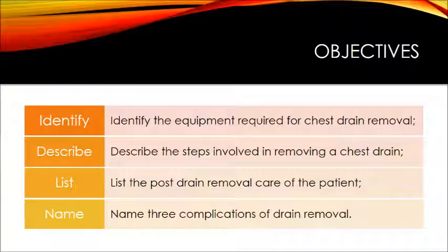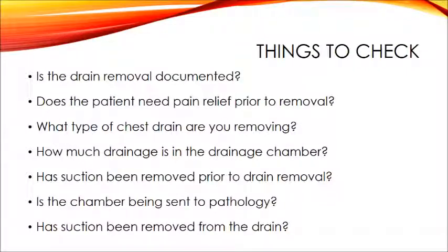This vodcast should be used in conjunction with Metro North's online chest drain learning package, which also examines the reason for chest drain insertion and the nursing management of a patient with a chest drain in. By the end of this session, you should be able to identify the equipment required for chest drain removal, describe the steps involved in removing a chest drain, list the post-drain removal care of the patient, and name 3 complications of chest drain removal.